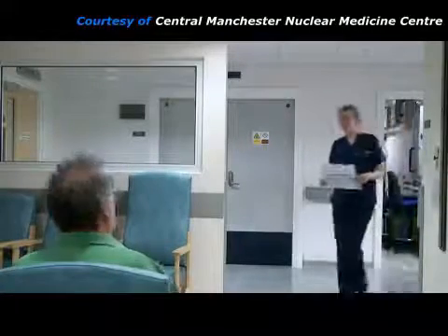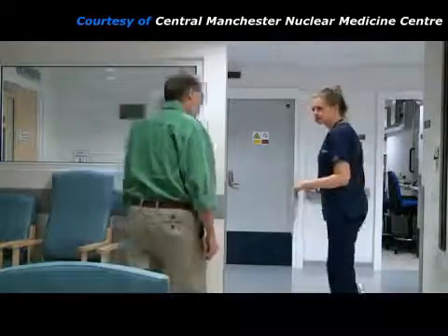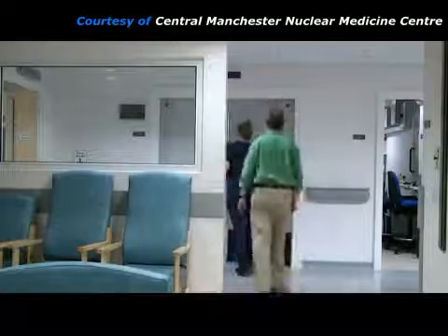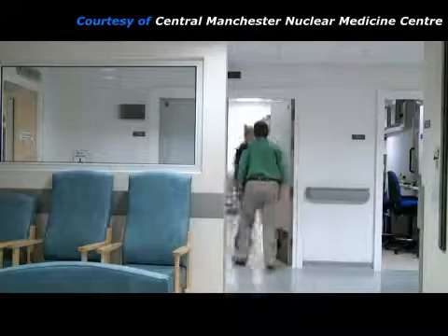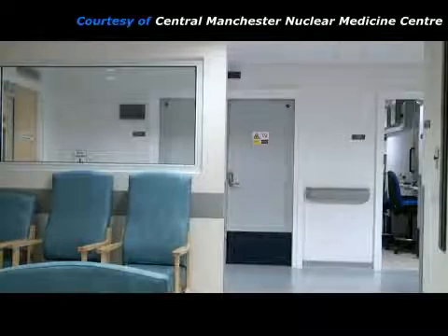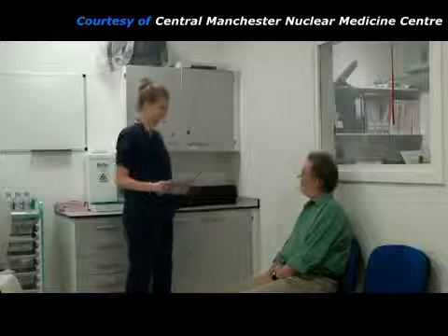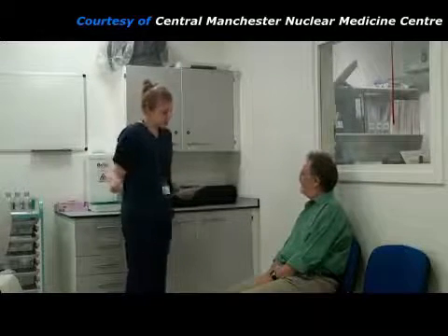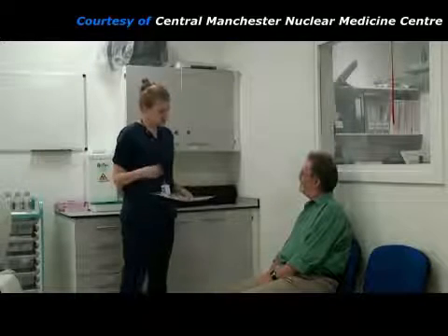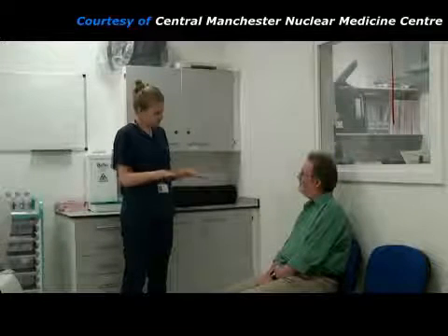This patient is having a myocardial perfusion imaging scan. About 1 hour ago, he was given an injection of a radioactive chemical known as a radiopharmaceutical, which will have concentrated in his heart muscle. A practitioner takes him into the gamma camera room where pictures of his heart will be taken. The practitioner checks the patient's identification to make sure she has the correct person, and then she explains what will happen during the scan.